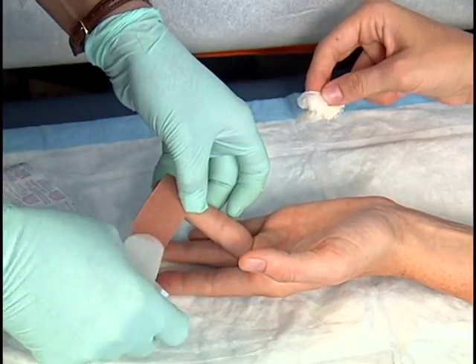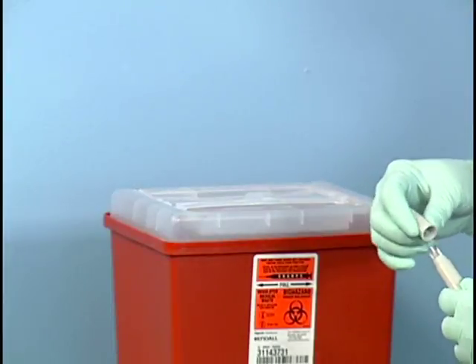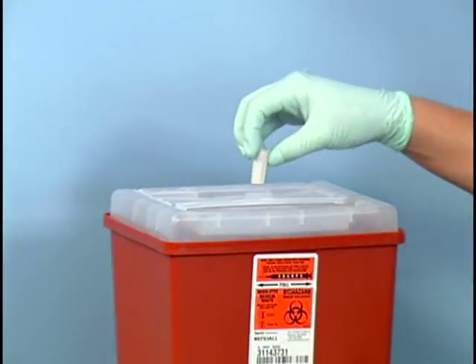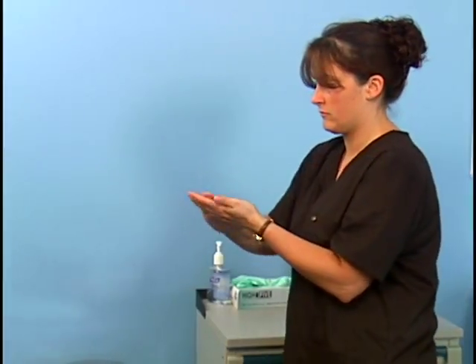Apply an adhesive bandage to the patient's finger if needed. Remove the end cap from the reusable device and discard it in a biohazard sharps container. Remove your gloves and sanitize your hands.